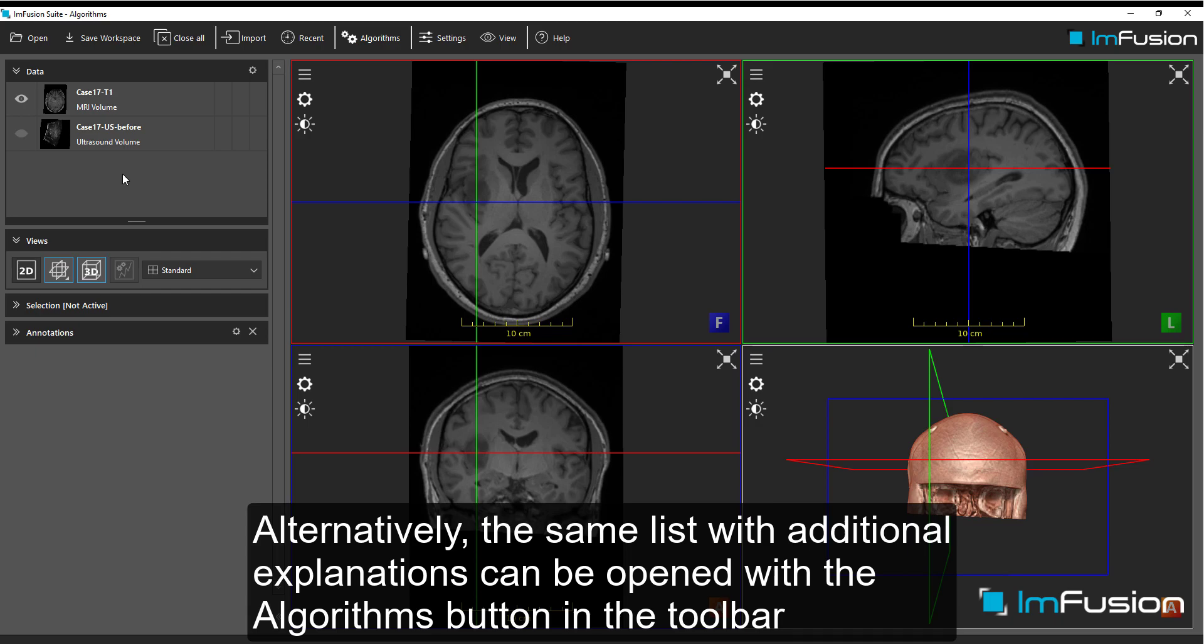Alternatively, the same list with additional explanations can be opened with the algorithms button in the toolbar.